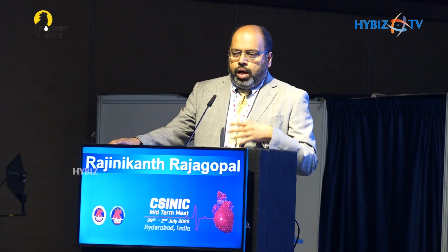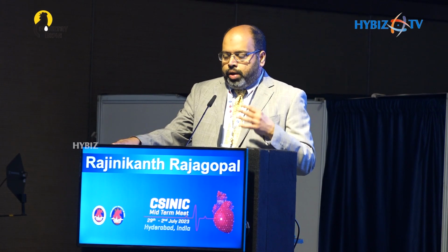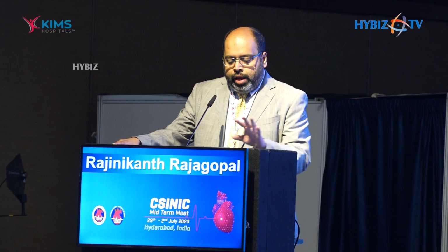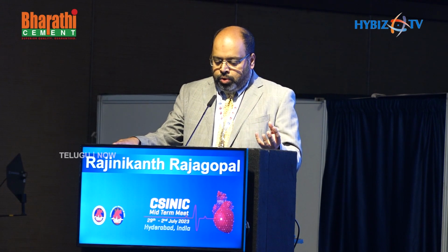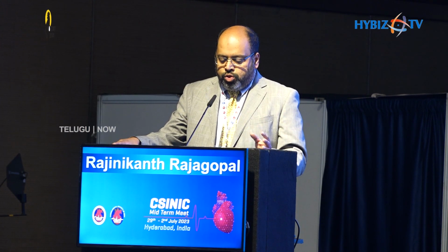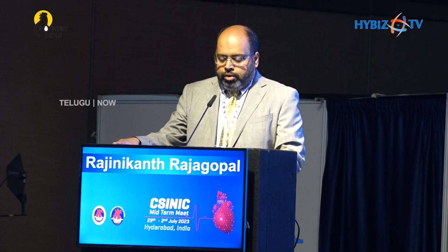So once you understand this, you put them together, and there are various algorithms to guide your treatment. This is what I practice in my everyday sort of in the lab. So when I look at in-stent restenosis, I do imaging first, and I call it either mechanical or biological. If it's mechanical, try to understand the mechanism on OCT. Under expansion is the most common, or undersizing, maybe stent fracture.